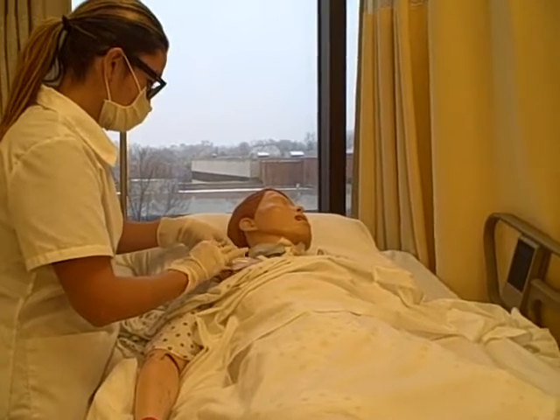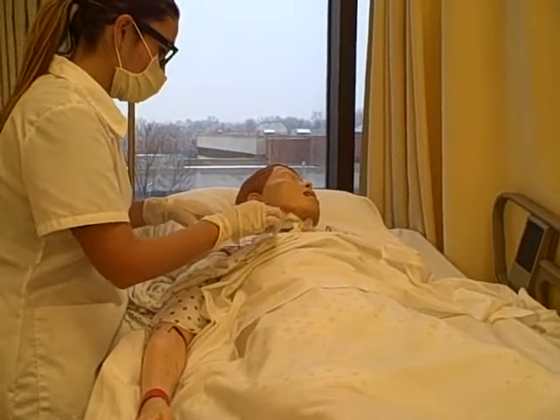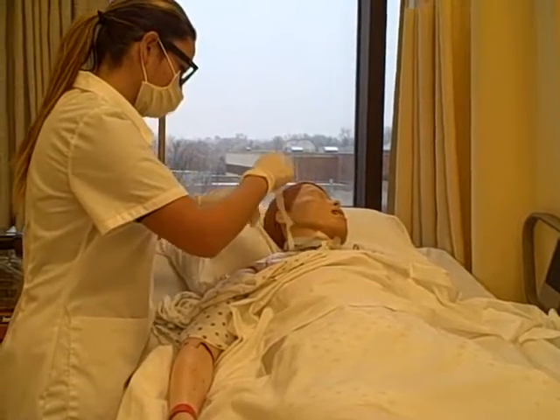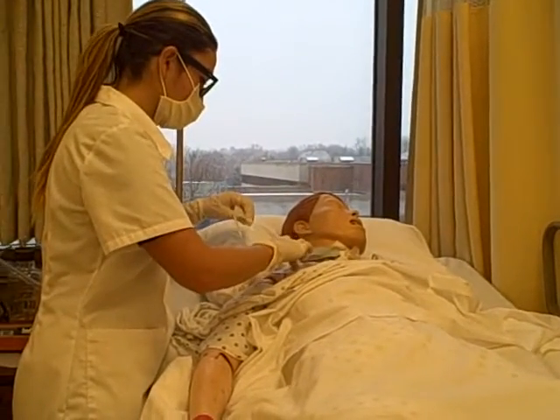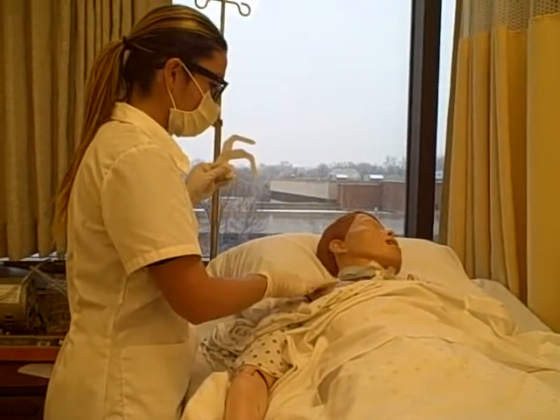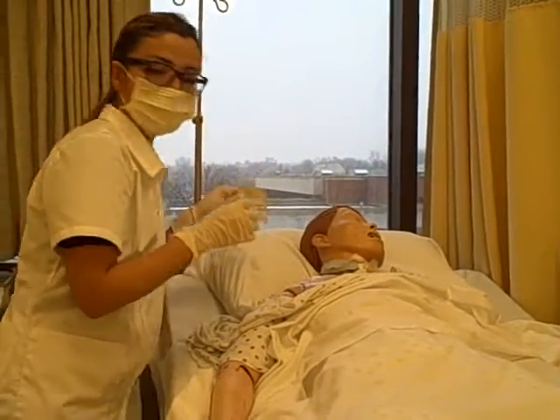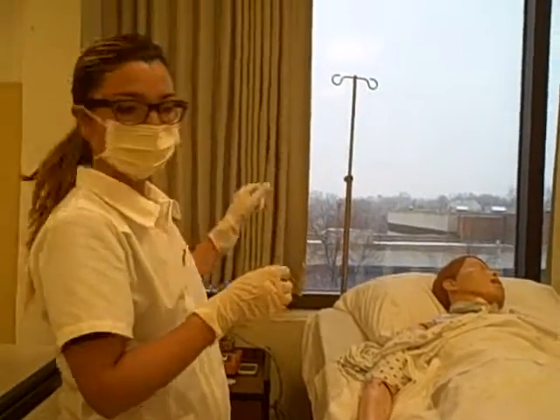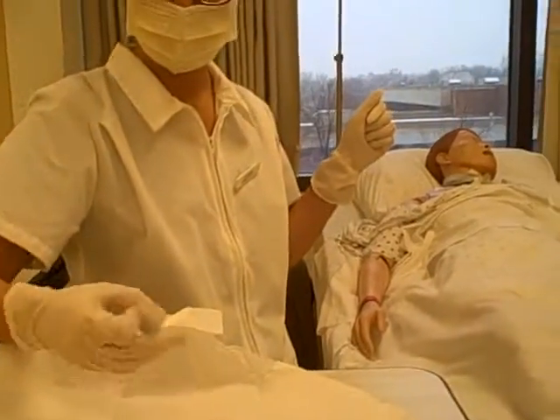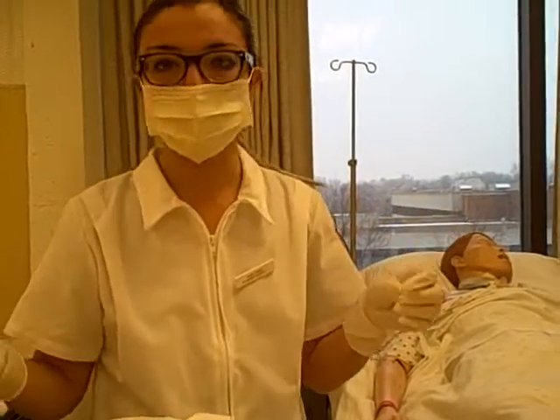Okay. And we can go ahead and get rid of the little paper edge. To make sure that, I'm going to get rid of that, of course. You put a little piece of tape, a little tag, anything that indicates the date and time and your initials, and of course you are going to document it in your nurse's notes.